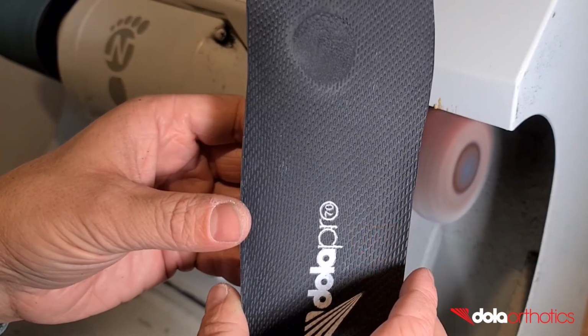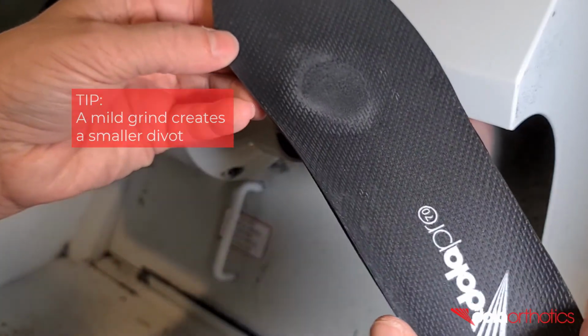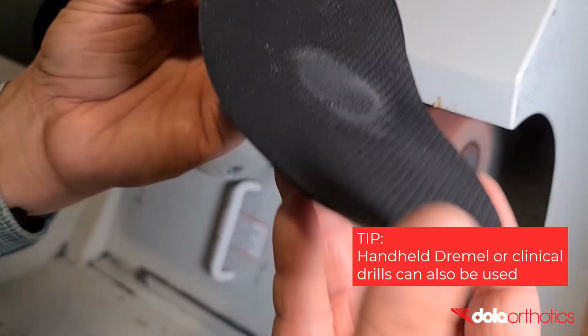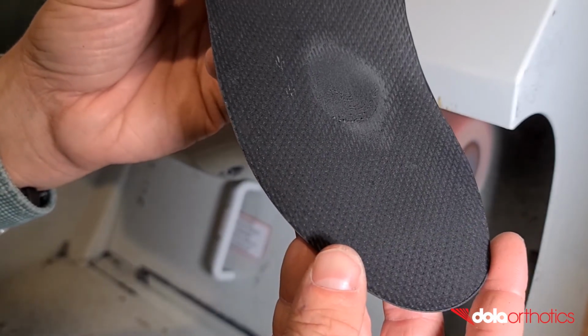A mild grind will create a small divot, a more aggressive grind will create a deeper divot. The grind can be smoothed with sandpaper or a Dremel. Alternatively, a divot can be made with a handheld Dremel grinder or even a burr attachment on a clinical drill.